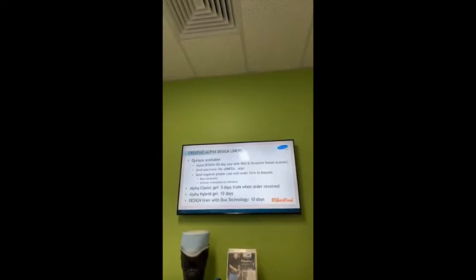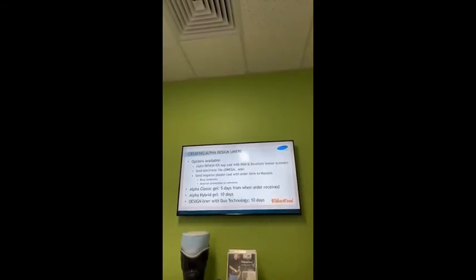So what that means is, if we sent a scan to WillowWood on a Monday, if it was classic gel, it would most likely leave that Friday from WillowWood back to Australia, or the following Friday if it was the hybrid or the Duo technology. So it just depends on when we send that file to WillowWood during the week on when it would leave. So we're looking anywhere from a 1 week to a 3 week turnaround to get it back out to us in Australia.